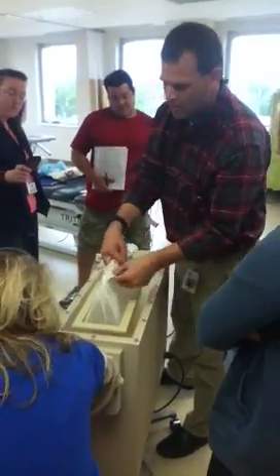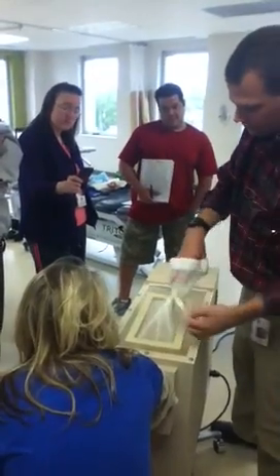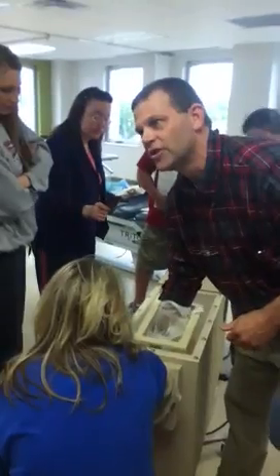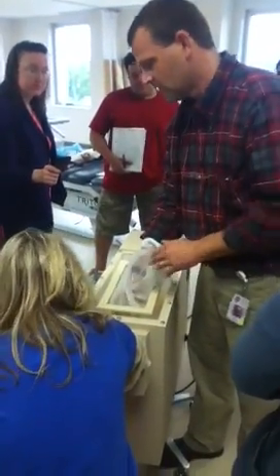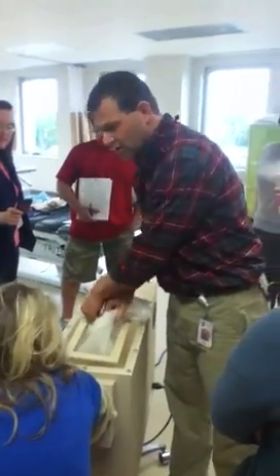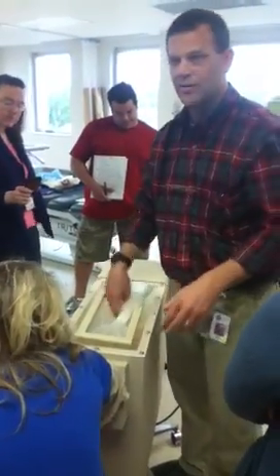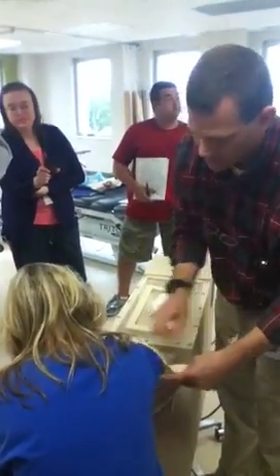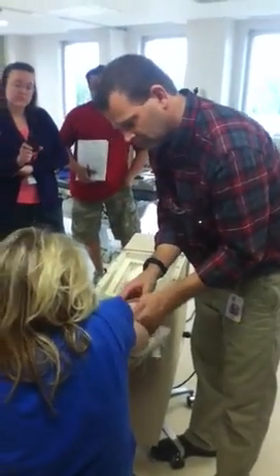So now I might have her be doing some opposition, or rolling her hand back and forth, or laying it wide and down close. As a clinician, I might actually use this one and stick my hand in there too. So now I can get in there with her and stretch her fingers while she's doing activities. The only thing coming out is making sure I don't make a big mess — try to kind of brush her off as she comes out.